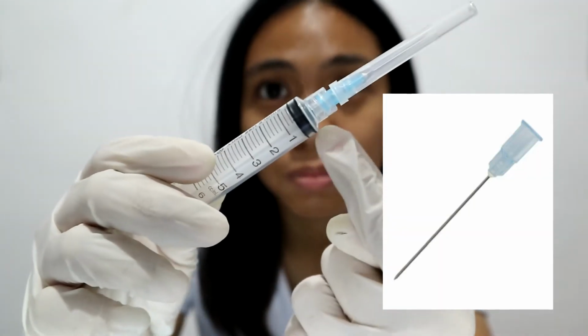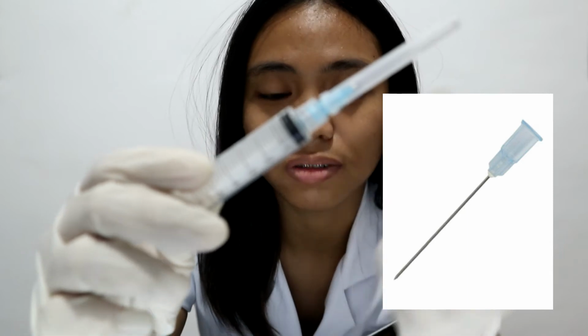Okay. There is another part in the syringe that you should take note of, and that is the hub. This is the hub part of the syringe. So once there is blood in the hub of the syringe, it will automatically indicate that you have hit the vein and it is now ready to be drawn out. So note that before pulling the plunger, release the tourniquet first. So once there is blood, release the tourniquet, then pull the plunger until the barrel is full or until you have reached the desired volume of blood you needed.